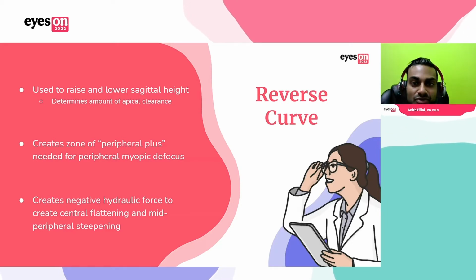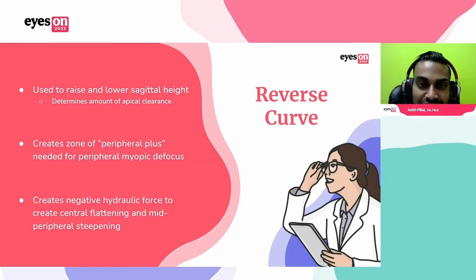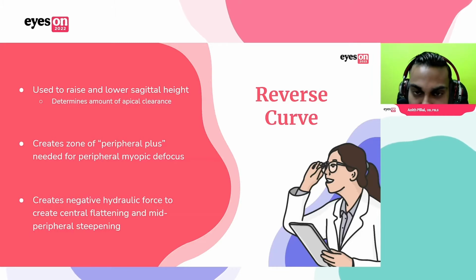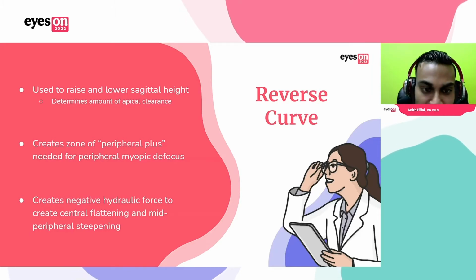This is also where you're going to raise and lower the system. So if you have too much sagittal depth or too little sagittal depth, not altering the base curve to manipulate that, you're going to be altering the reverse curve.